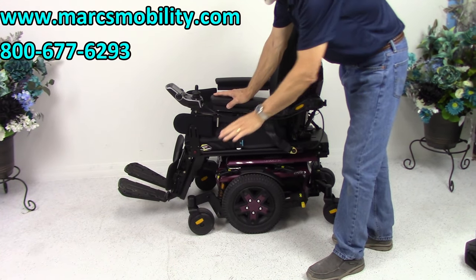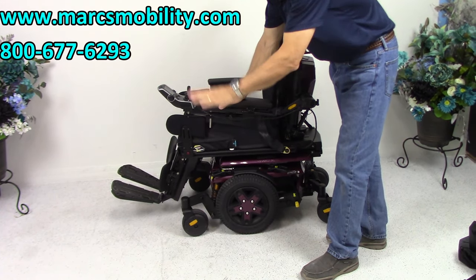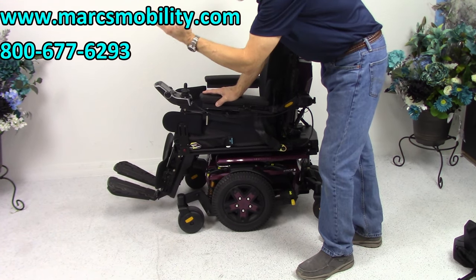This chair has the 12-inch seat lift, the electric tilt, the electric recline, and the electric legs.